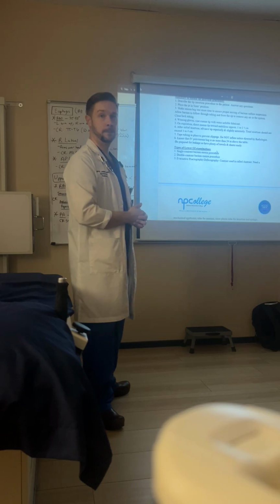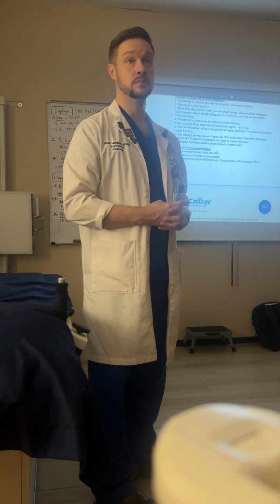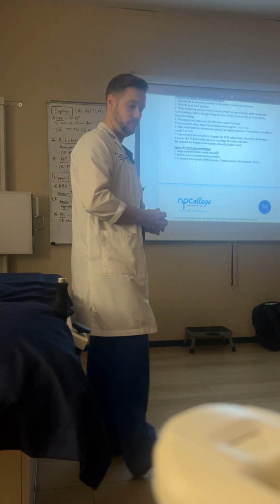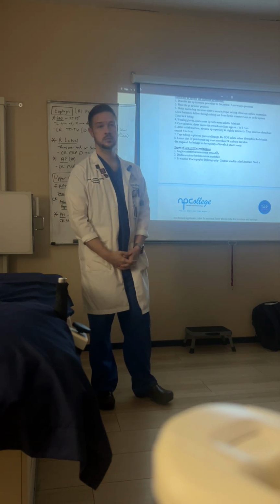So do you explain before the patient lays down in position, do you give them a breakdown step by step? Yeah, you're going to explain it step by step as it goes. They're absolutely going to the restroom as well. So when you bring them in, you explain it to them, tell them to change, and then you get them.